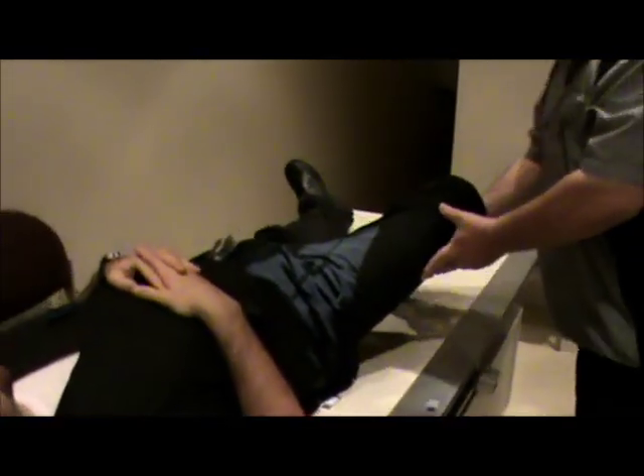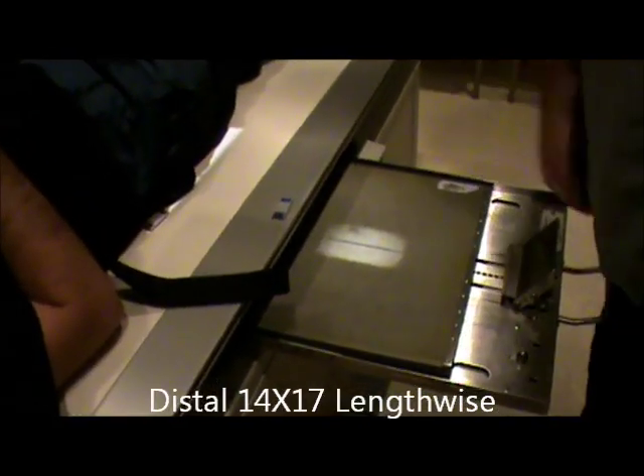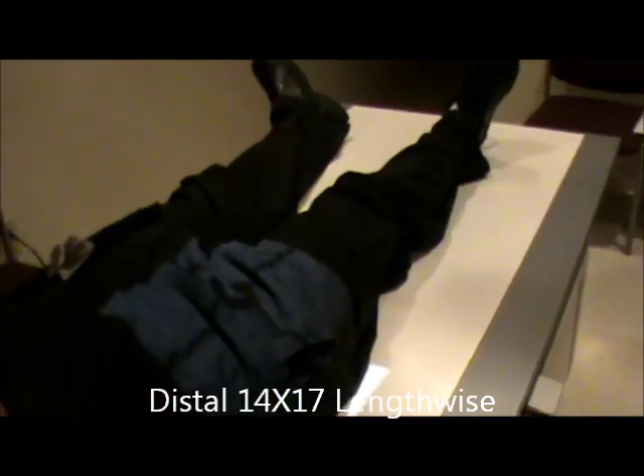The next film we're going to do is have the patient lay their legs back down flat. We're going to change film size — we're going to use a 14 by 17 lengthwise. For the AP distal femur, we're going to palpate the knee. Here's the patella, and approximately a half inch below the patella is the joint space, so I'm going to put my light there. I need to see the entire joint approximately, so the film is now about one to two inches below the joint space, which is acceptable.